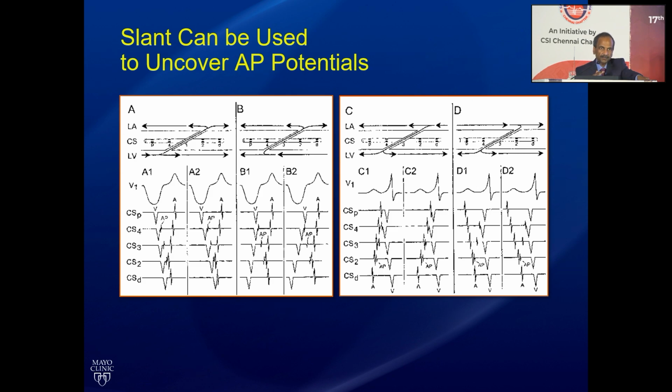V is nearer septum or V is away from septum. What do you want to avoid? Where you want to put your second burn? Simple case, doesn't matter the slant. Difficult case, good to find pathway, good to understand the slant, and then you consciously take your best shot.